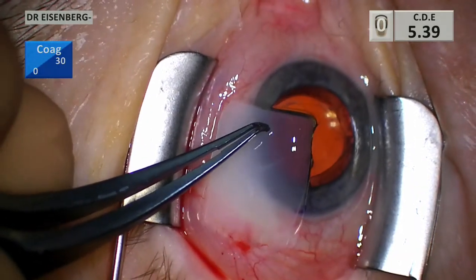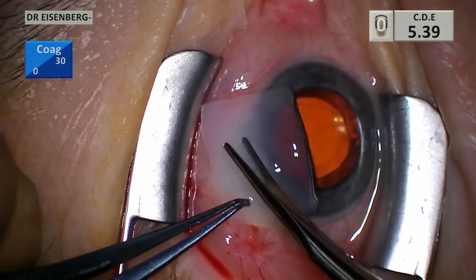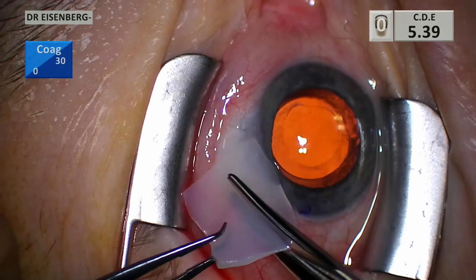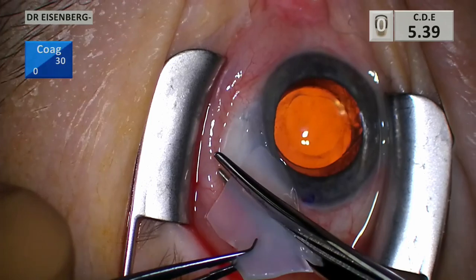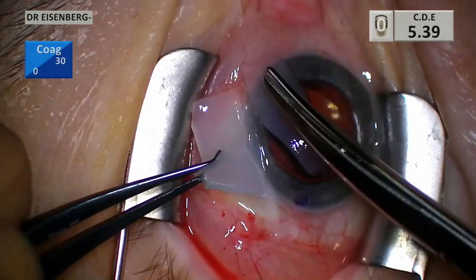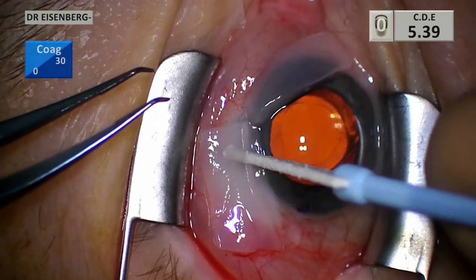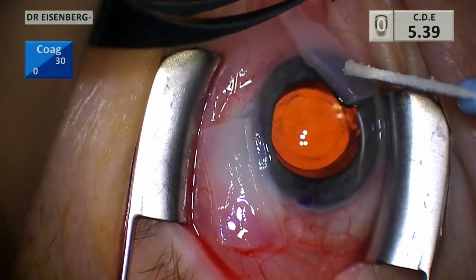Here's our amniograft — I have no financial ties to these people; the material works extremely well and I've been using it for at least a decade. What I do first is trim it to about the size of the bleb. It doesn't have to be precise, but I don't want too much material flopping around. Now I'm going to demonstrate the epithelial side versus the membrane side: when I touch the epithelial side, the Weck-Cel does not stick; touching the membrane side, it sticks quite well.